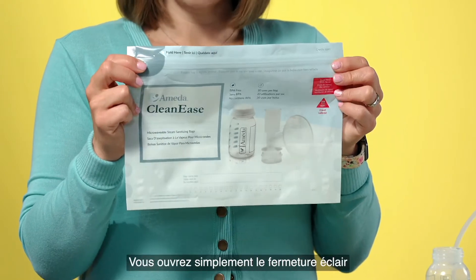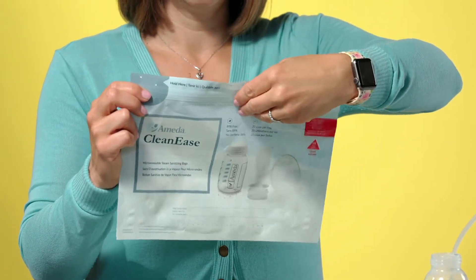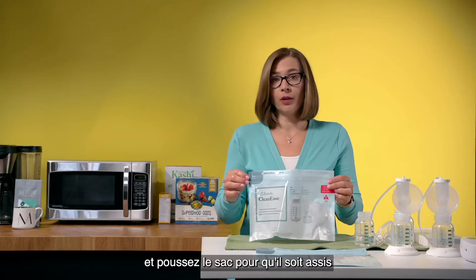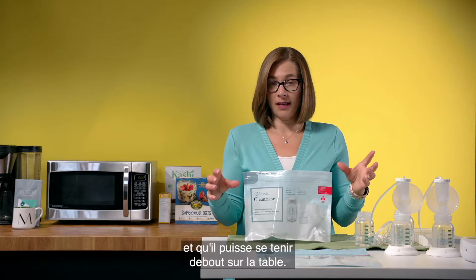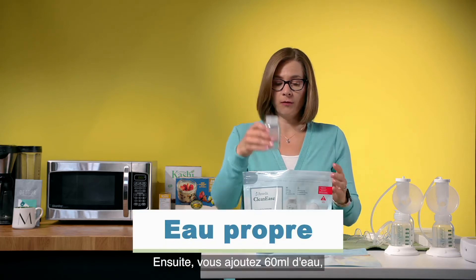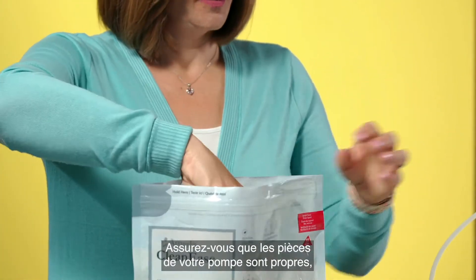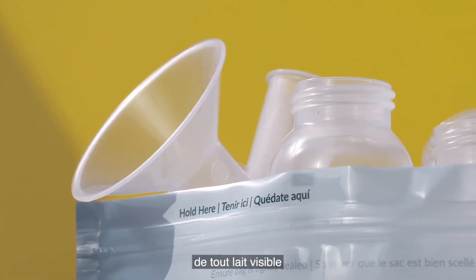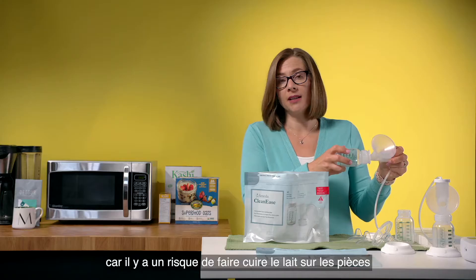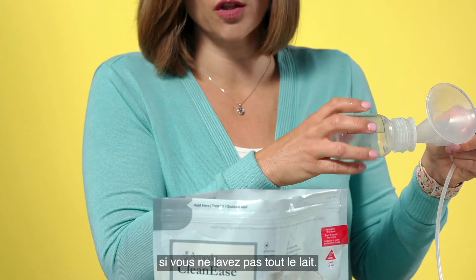How it works is it's like a Ziploc bag. You simply open the zip and push the bag so that it's sitting and can stand on the table. Then you add 60 mils of water and then add your pump parts. Make sure that your pump parts are clean of all visible milk and you've washed them before you put them in the bag, because there's a risk of cooking the milk on them if you don't wash off all the milk.